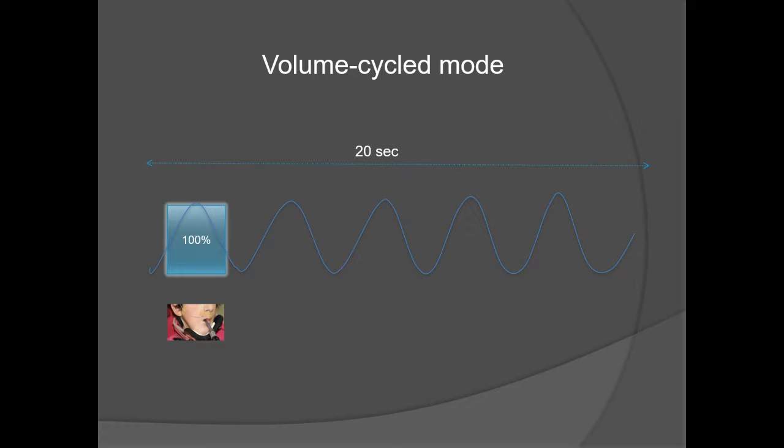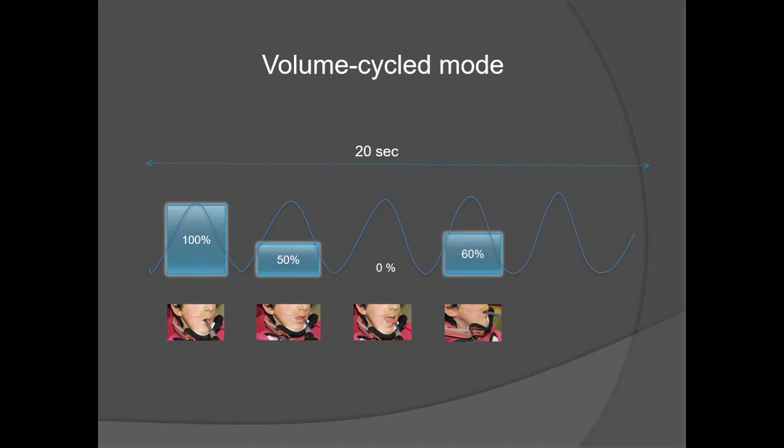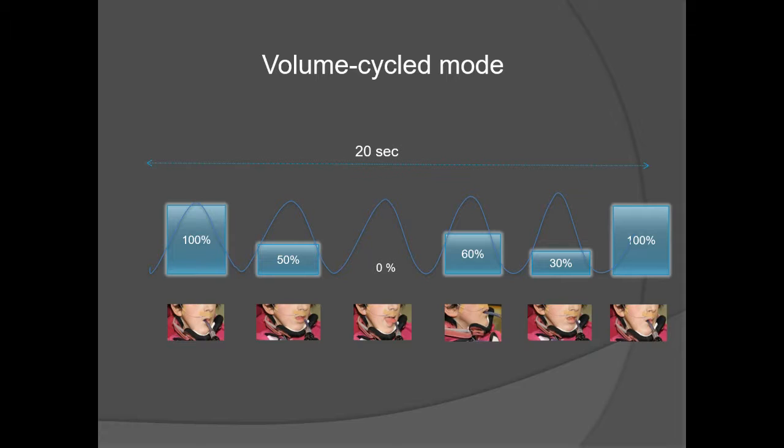we see? We see that patients can have the choice regarding the amount of air they want to take in their lungs. For instance, they can take 100% of the tidal volume, but they also can decide to take only 50%, and the 50% remaining volume is going in the air of the room. And then, for instance, they say, okay, I have enough air. They can totally release the mouthpiece and take 0% of the air. Then, for instance, 60%, then 30%, and then, for instance, when they want again some more air, pursing the lips perfectly and taking 100% of the air.